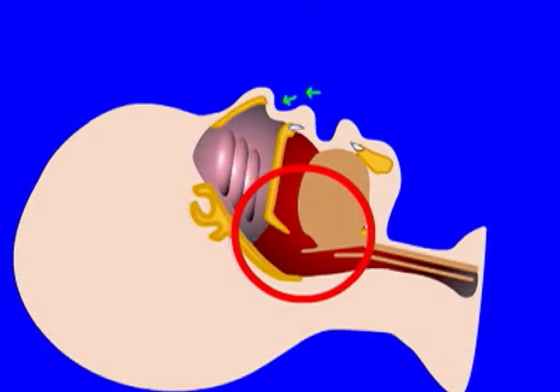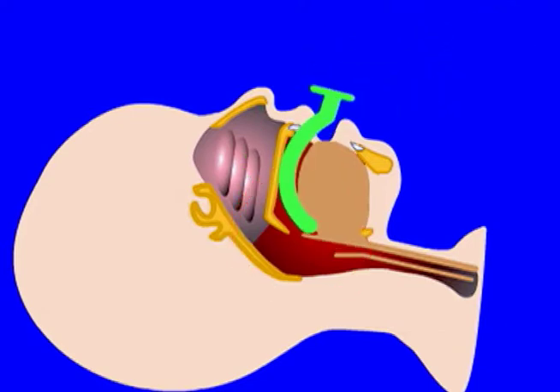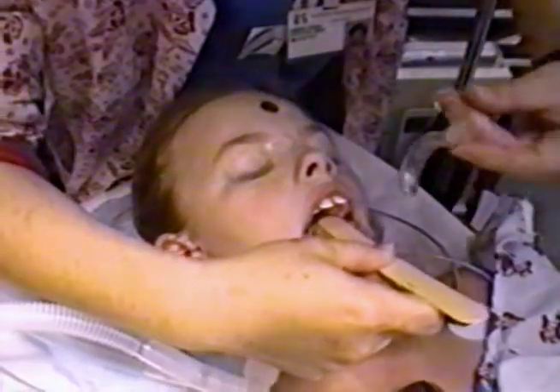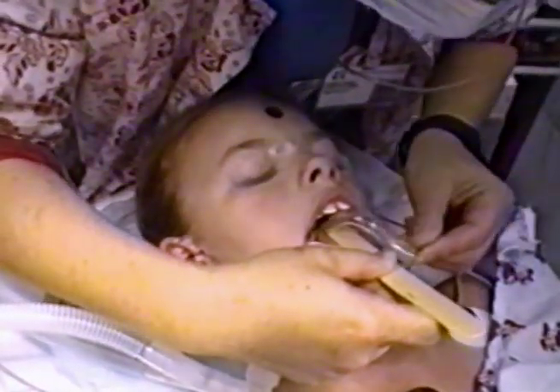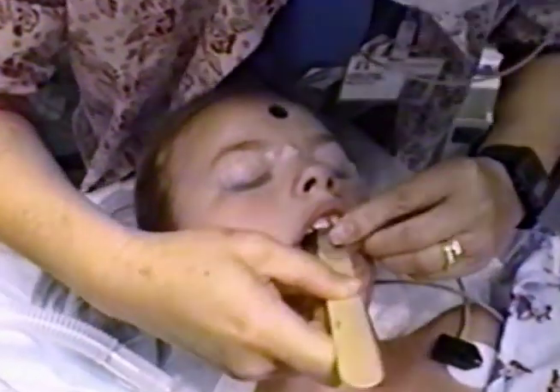Open the mouth as wide as you can and insert the oral airway. Slowly advance it until the tip is behind the back of the tongue. You can use a tongue depressor with your left hand to open the mouth and push the tongue down. Place the tongue depressor to the rear of the tongue and pull it forward.